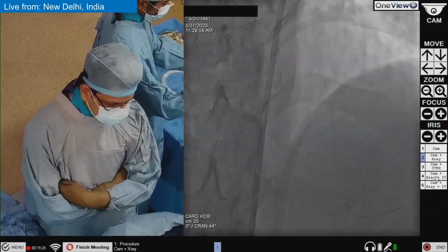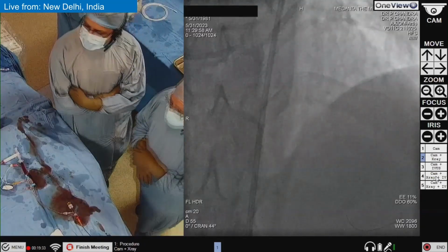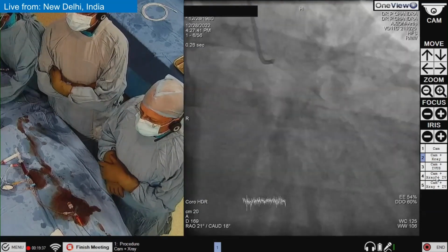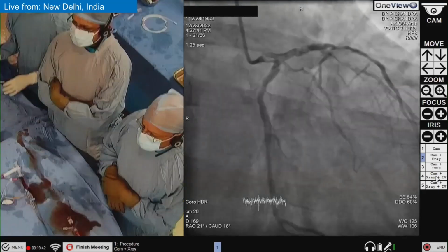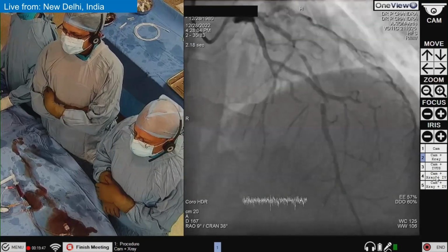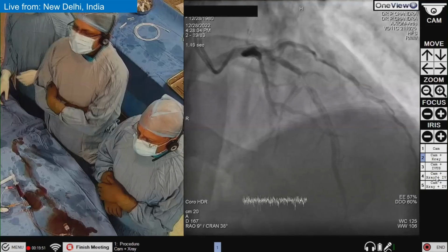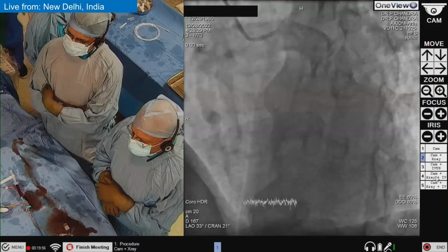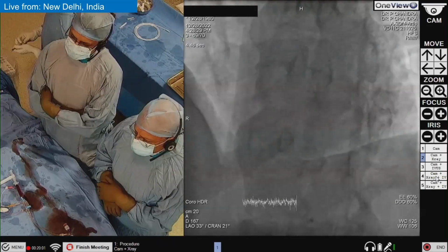And this is the angiography image, from the previous angiogram, which was done in December 2022. So you can see here, the left main is fine. Circumflex has a lesion, which is maybe 40-50% in the mid part. There is a small ramus, which is okay. Next slide. You can see there's the early diagonal, which has some lesion, maybe 50-60%, but LAD is very tight and calcified also in proximal and mid part with almost 90% lesions. And diagonal has around 70% lesion in the mid part.